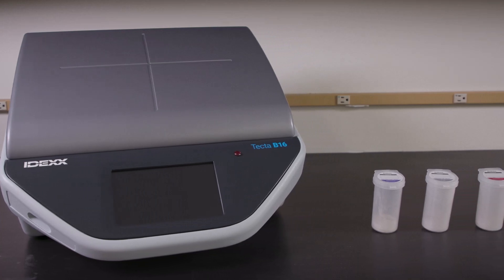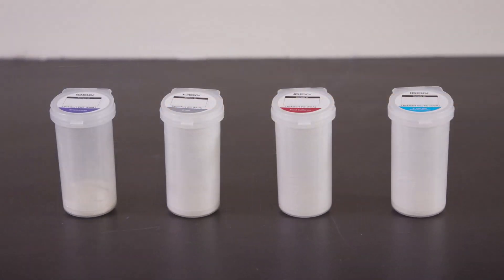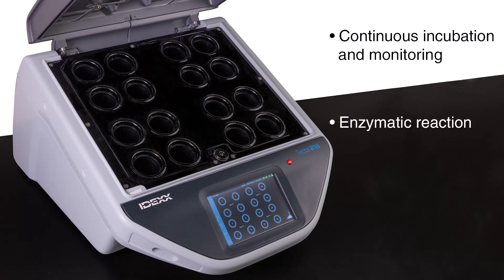The TECTA B16 has a 16-chamber capacity and can be run with four different Tectalert cartridges, each available in a 100-milliliter format. The TECTA instrument continuously incubates and monitors each sample. The onboard optical system monitors for an enzymatic reaction similar to what is used in other IDEX methods, like Colalert.